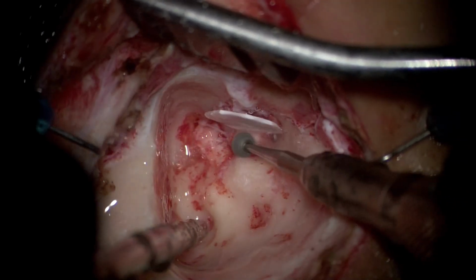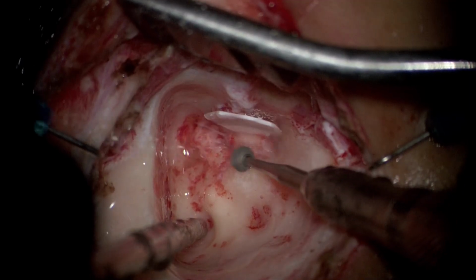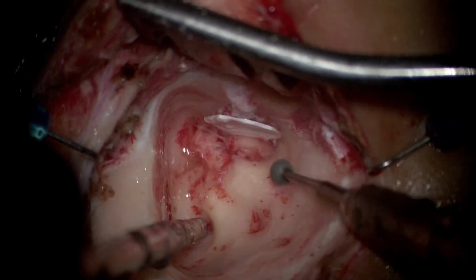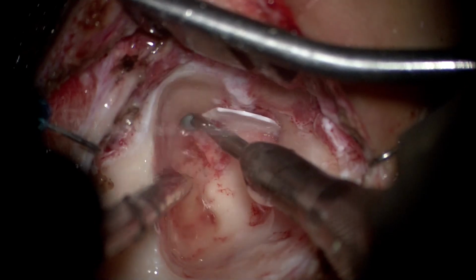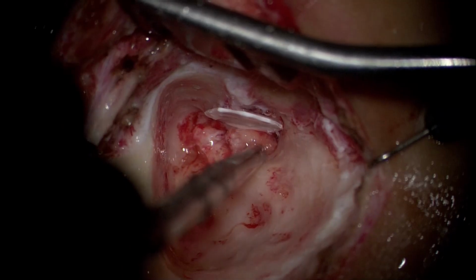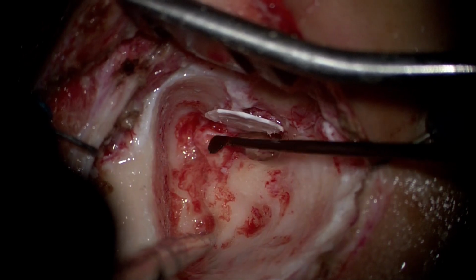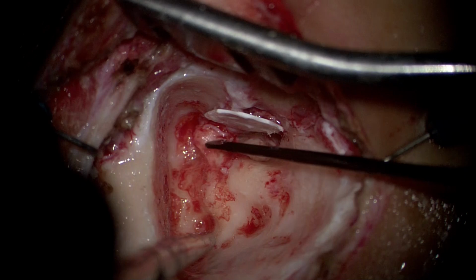Now, while mastoid drilling is something that one can learn from actual clinical cases, as well as temporal bone dissections, which is now quite common all around, including simulations, the actual soft tissue dissection inside the mesotympanum, particularly with regard to cholesteatoma, is something that most dissections or simulations fail to achieve. So, in this instance, we see that a canal wall down mastoidectomy has been crafted with a low facial ridge.